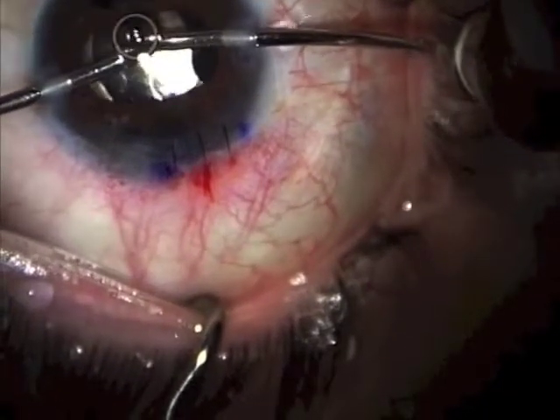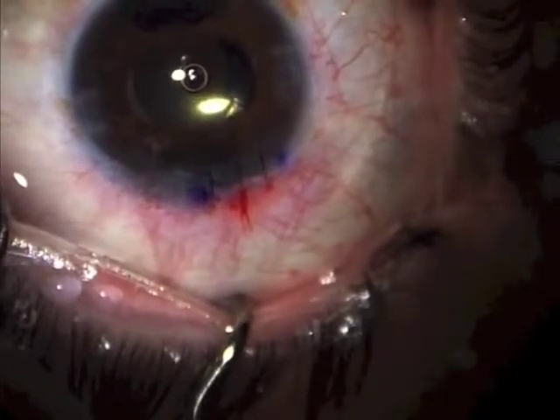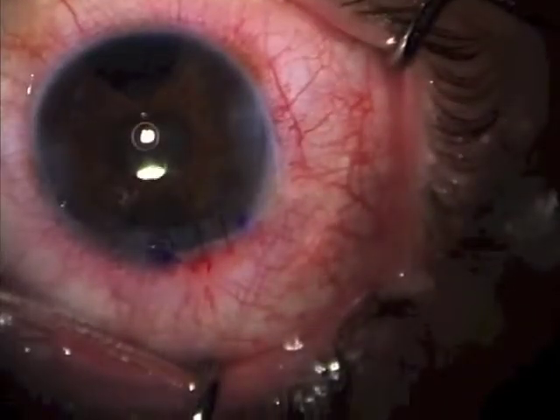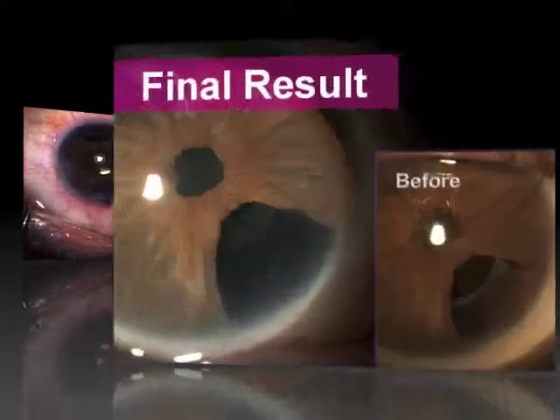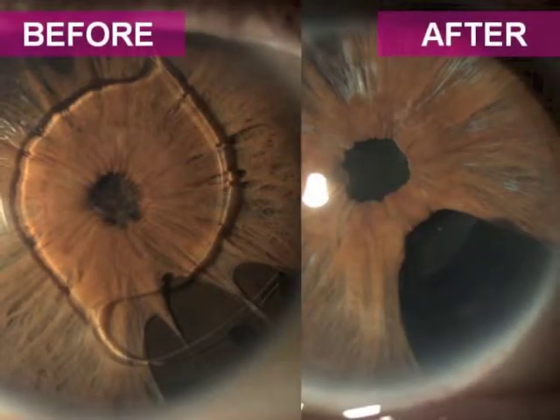We sutured the incision and the viscoelastic was washed. We injected acetylcholine to check if the aniridia ring was in the correct position to cover the iris defect. Glare and diplopia disappeared from the first day after surgery. Uncorrected visual acuity was 20/25 and best corrected visual acuity was 20/15, with a refraction of +1 minus 1.5 by 155 degrees.